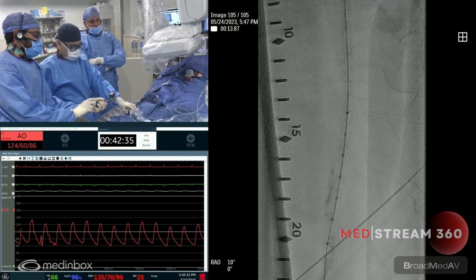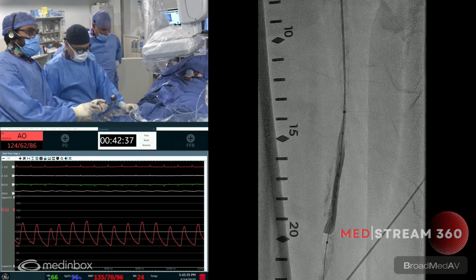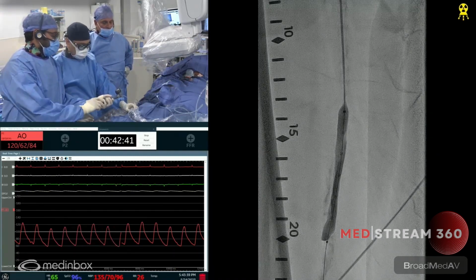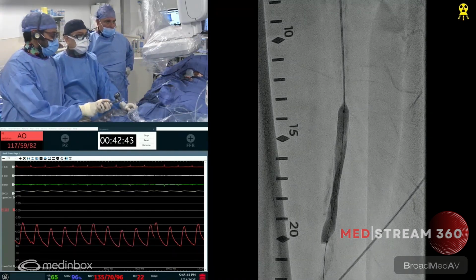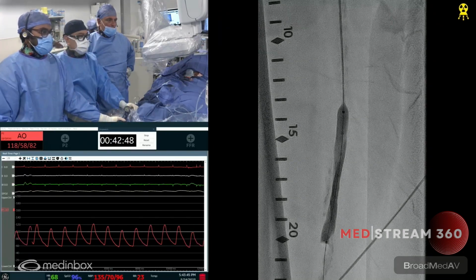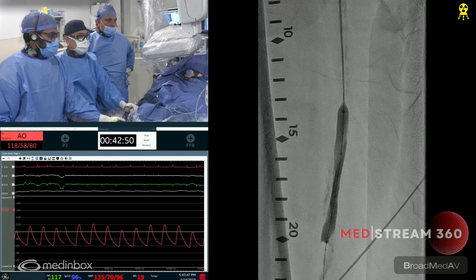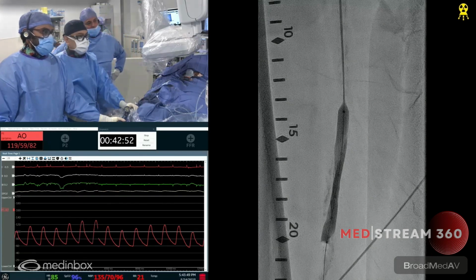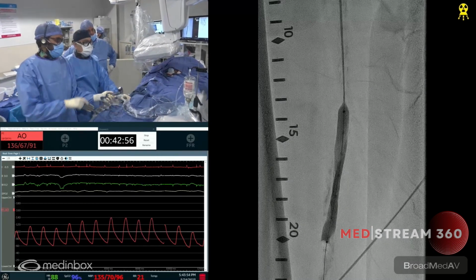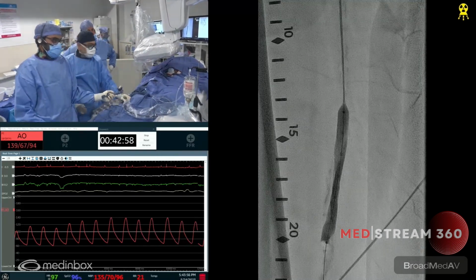So Ibrahim, can you talk about the technique here? So I'm going to go up to 4, and then once it's at 4, we're going to engage some of the vessel. Ray is going to deliver the pulses. So at each one of those dots, IVL or lithotripsy is being delivered, and the hope is to create some cracks in the calcium, and we'll see if we crack the calcium when I go up to a higher pressure of 6 or 8.